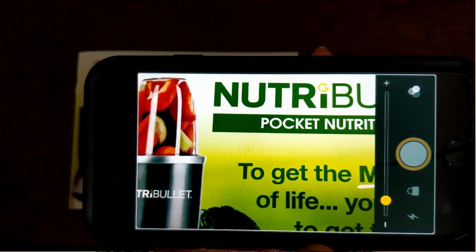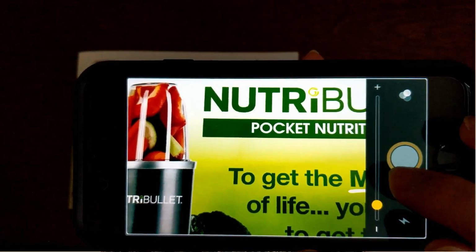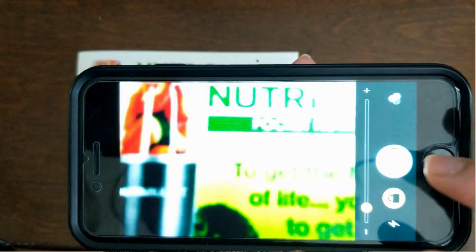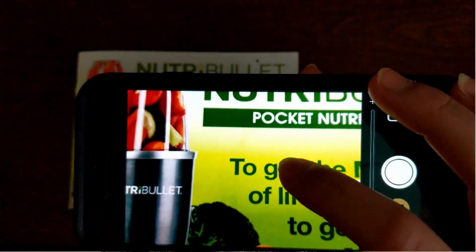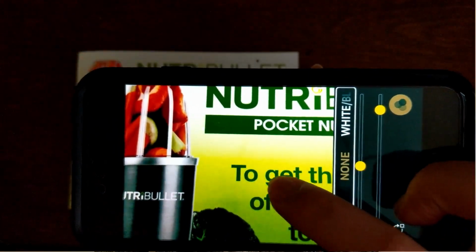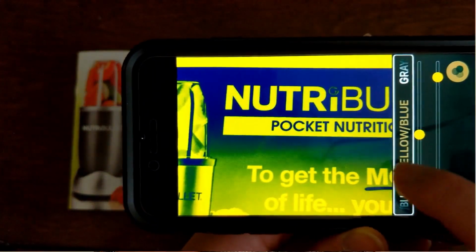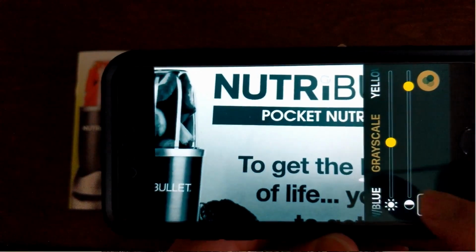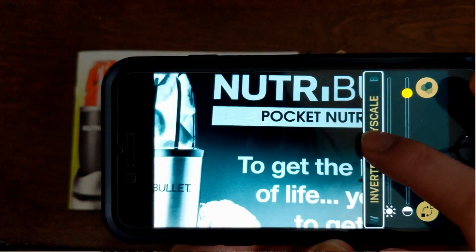After that is the freeze frame button, and you can use that to take a picture and then you can zoom in and pan around and read it that way if you want. The last option that shows up here is filter. If you select that, it will take you to new controls where you can change the color filter, you can change the brightness and the contrast, or invert the colors, or return to the magnifier.